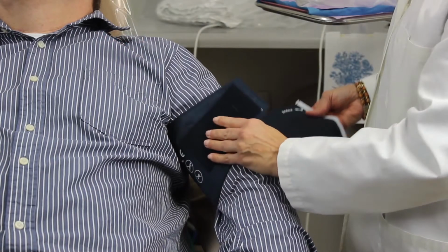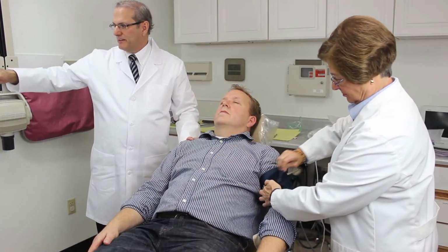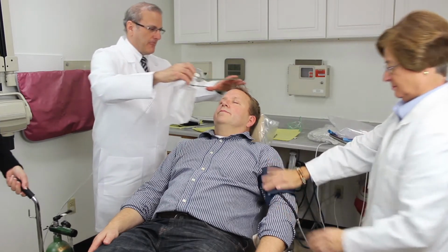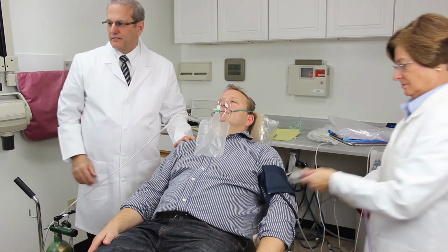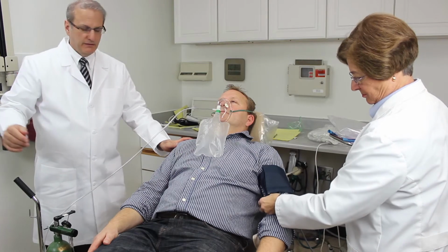Williams? Are you having any difficulty breathing? Well, let's go ahead and get the monitors on Mr. Williams, and let's get the treatment equipment. Mr. Williams' blood pressure seems to be high, and he is breathing rapidly. It appears that he's doing this because he is under a bit of stress. Make sure the oxygen is adjusted properly. We've put the oxygen on Mr.